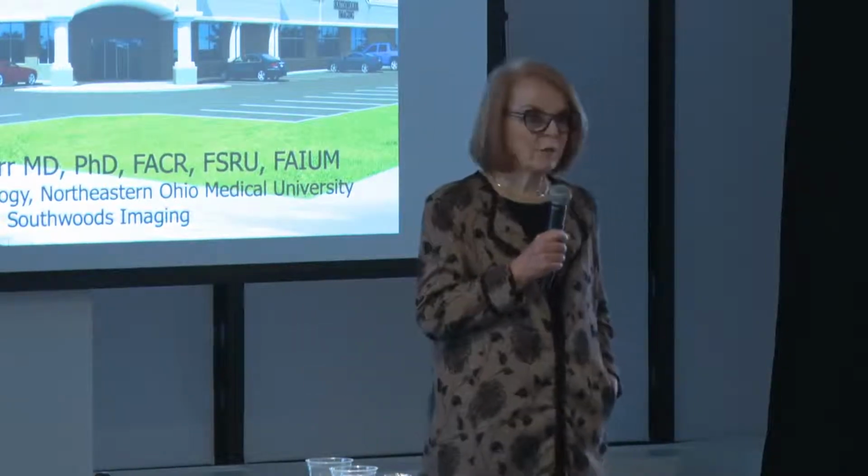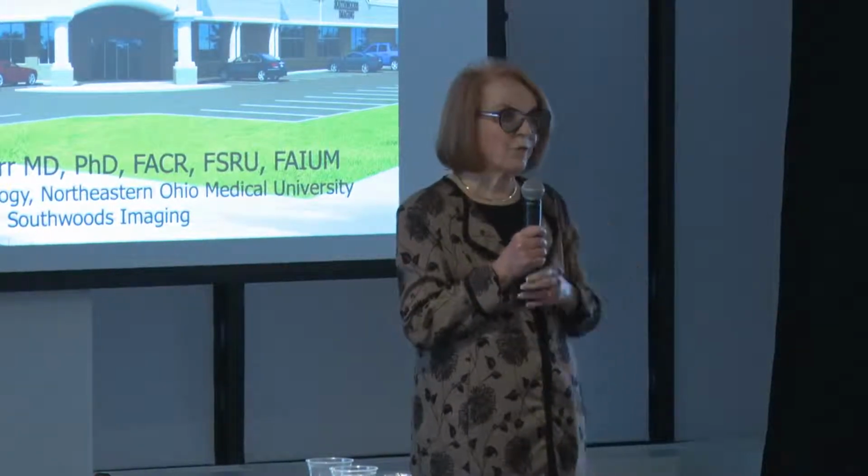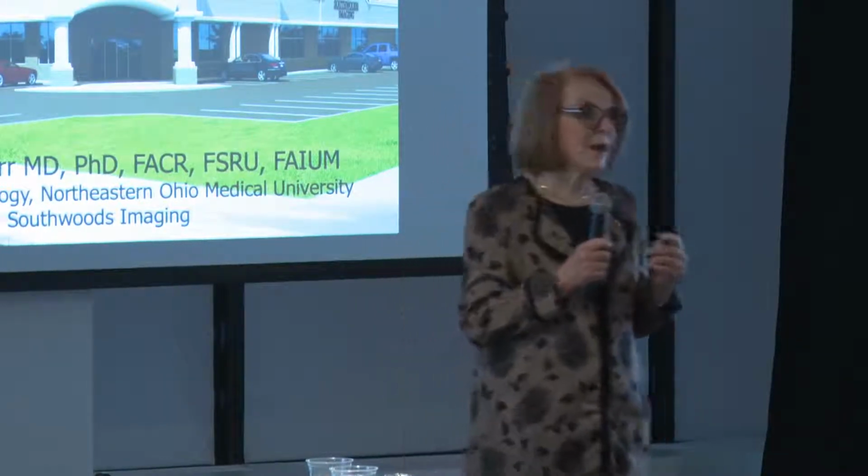Do any of them demonstrate a washout? Oh, yes. Occasionally. In our own study that we did a long, long time ago, we thought maybe as many as 10% can show some washout. But here is kind of a philosophy that I have that's maybe not the safest thing to say, but I end up saying it to my students so often I realize that this is an issue. When I'm thinking that a patient has FNH or hemangioma, right when I'm doing the scan, I'm doing the injection, I'm thinking this is FNH or I'm thinking this is hemangioma. With hemangioma, if I'm really sure that that's what I think it is, if it subsequently shows some washout, I just say, I don't care. I'm not going there. I'd say hemangioma.